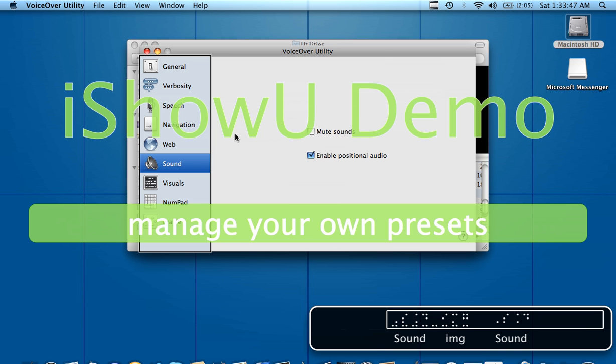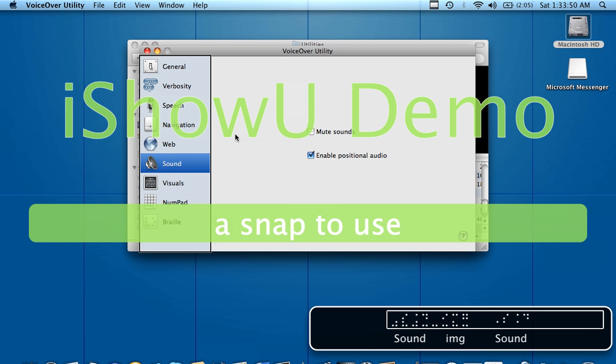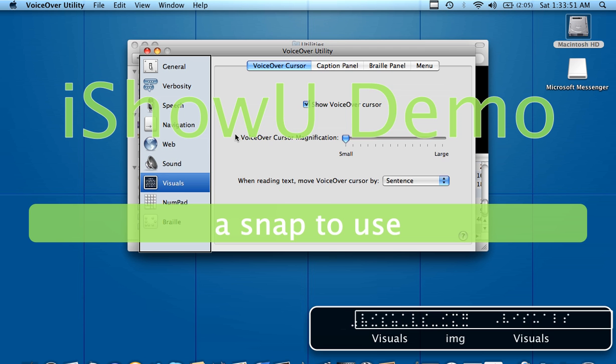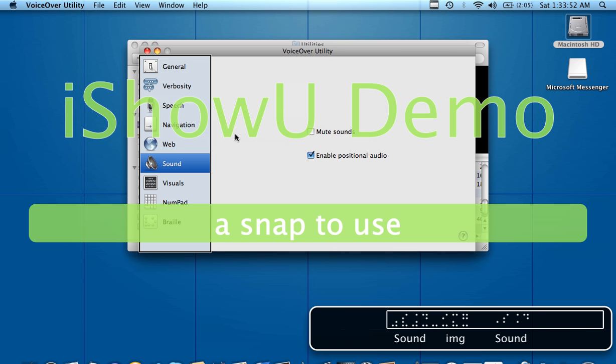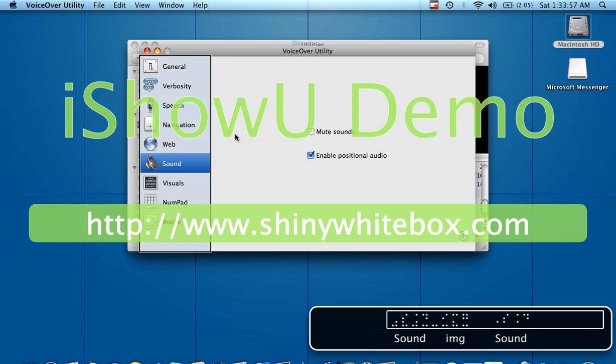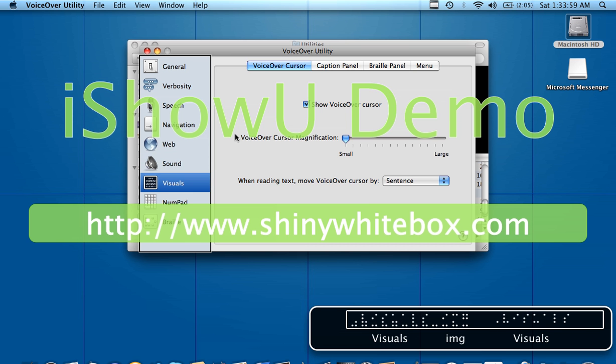Those little dots that you heard, those little blips. Row, row 6, Sound, image sound. That blip right there, row, row 6, Sound, image sound. Right after it said row 6 and you heard that little blip, that's what that is.